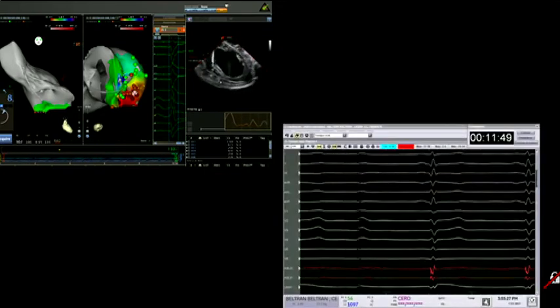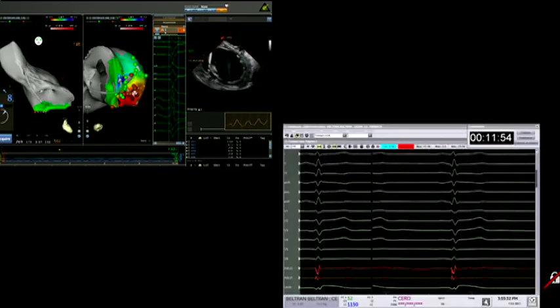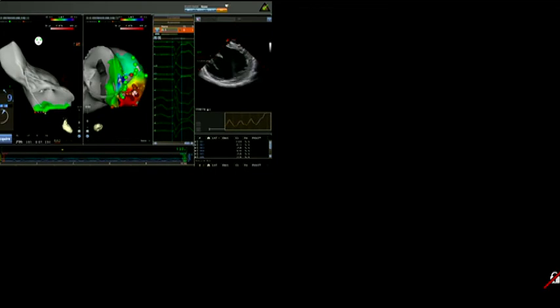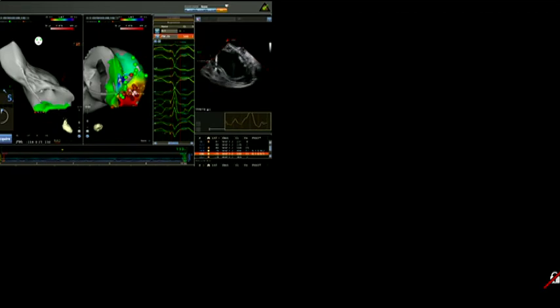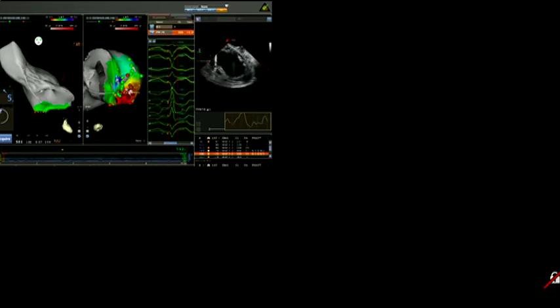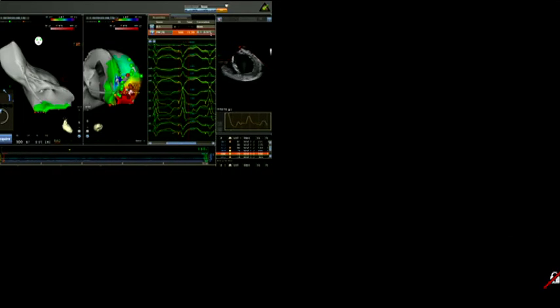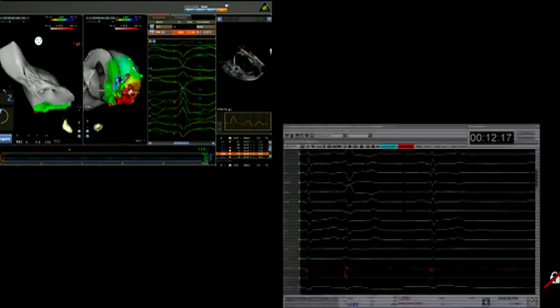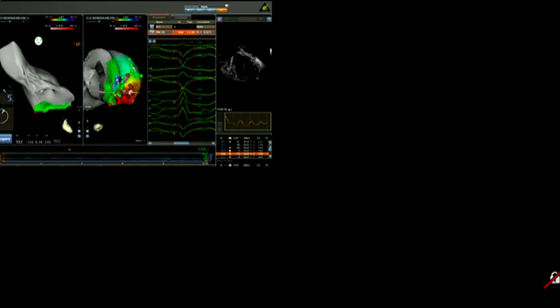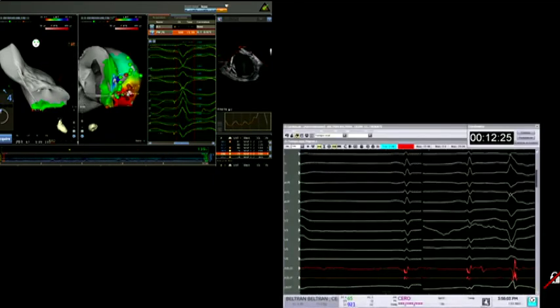So in this area, we find very good maps, between 96 to 97% with clinical extrasystole and with very similar activation times, between 30 to 35 milliseconds, preceding the QRS. The problem of mapping around the papillary muscle, where there are too many Purkinje fibers, is that the activation times are very similar. It's very difficult to differentiate in 5 millimeters, and that's somewhat frustrating.